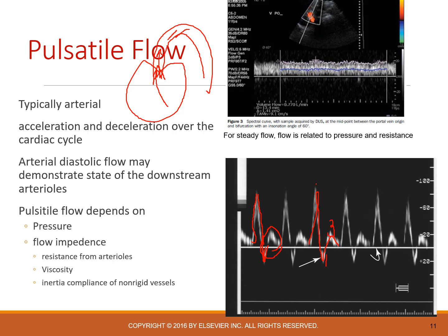Now, if I were to see this waveform in something like a resting leg muscle, I wouldn't be concerned, because it should have arterial constriction. It should have a lot of pressure pushing back. If I were to see this in the ovary or the testicle, or really any of my abdominal organs that have a high need for blood flow constantly, I would be very concerned.